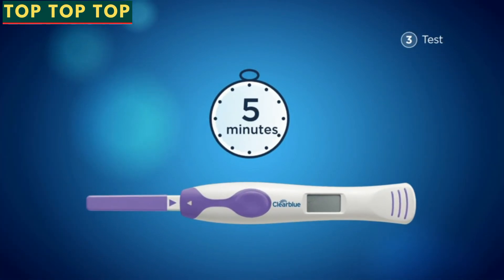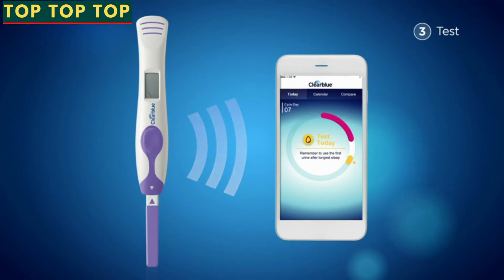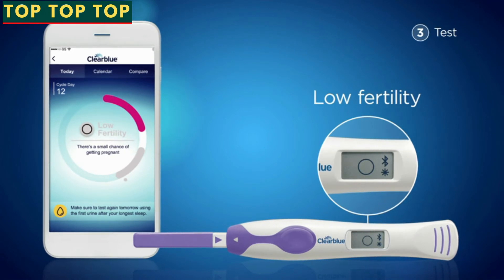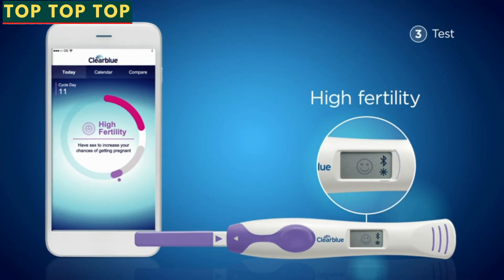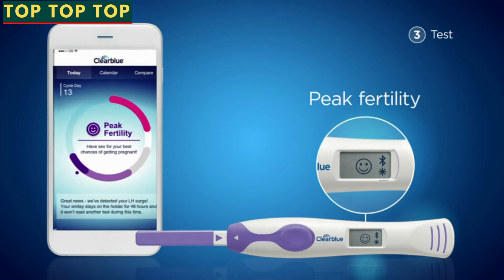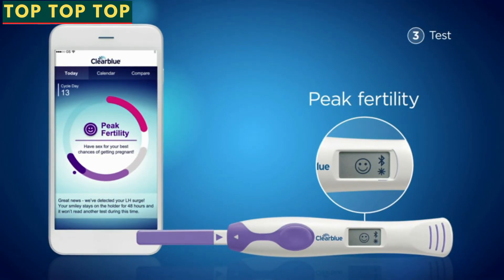Wait five minutes to reach your result. Your results will sync automatically when the Clearblue Connected app is open, Bluetooth is activated on your phone, and the phone is close to the holder. A circle means you have a small chance of getting pregnant today. A flashing smiley face means your estrogen rise has been detected and you have an increased chance of getting pregnant today. A constant smiley face means your LH surge has been detected — you have the highest chances of getting pregnant today and tomorrow.